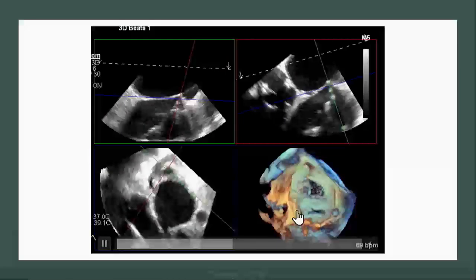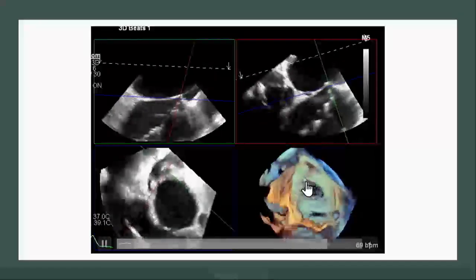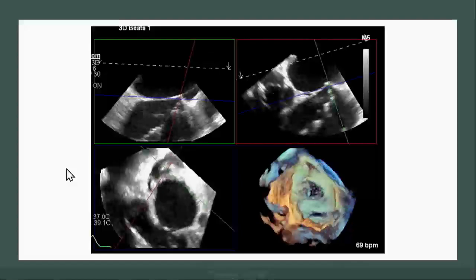So this is the mitral valve and this is the aortic valve. We try to go superior to get more height to reach the mitral valve, and a little bit posterior so we are not aorta hugging, and this is where we did the transseptal puncture.